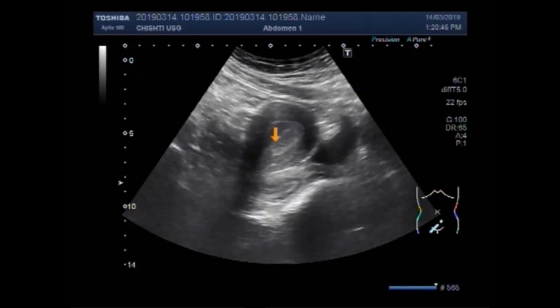Now, this evenly echogenic area here is a polyp — a uterine polyp.